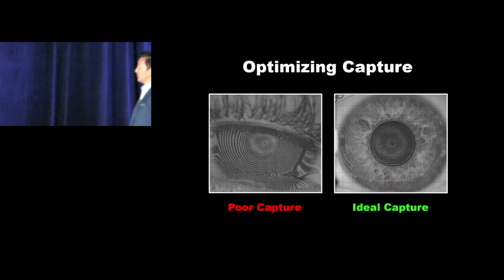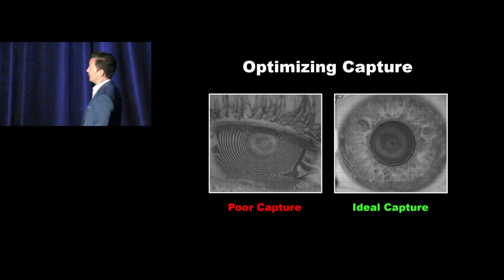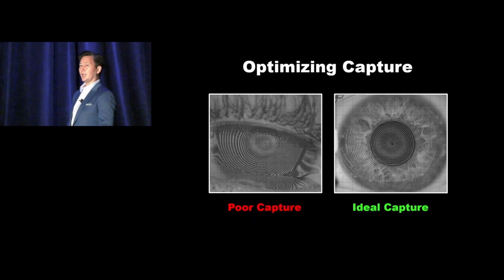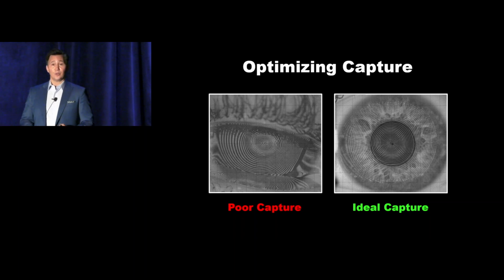Here's the same patient, one obviously with the fissure fairly small and the other open right up. You see the trouble with this capture here. We've got all of this lid coverage, the eyelash shadowing, the tear wedge down here. Do the best you can to open that up. It's going to be tough with kids, and there's no doubt that they're some of your biggest challenges in capturing topography, getting the fissure size open, but do the best you can.